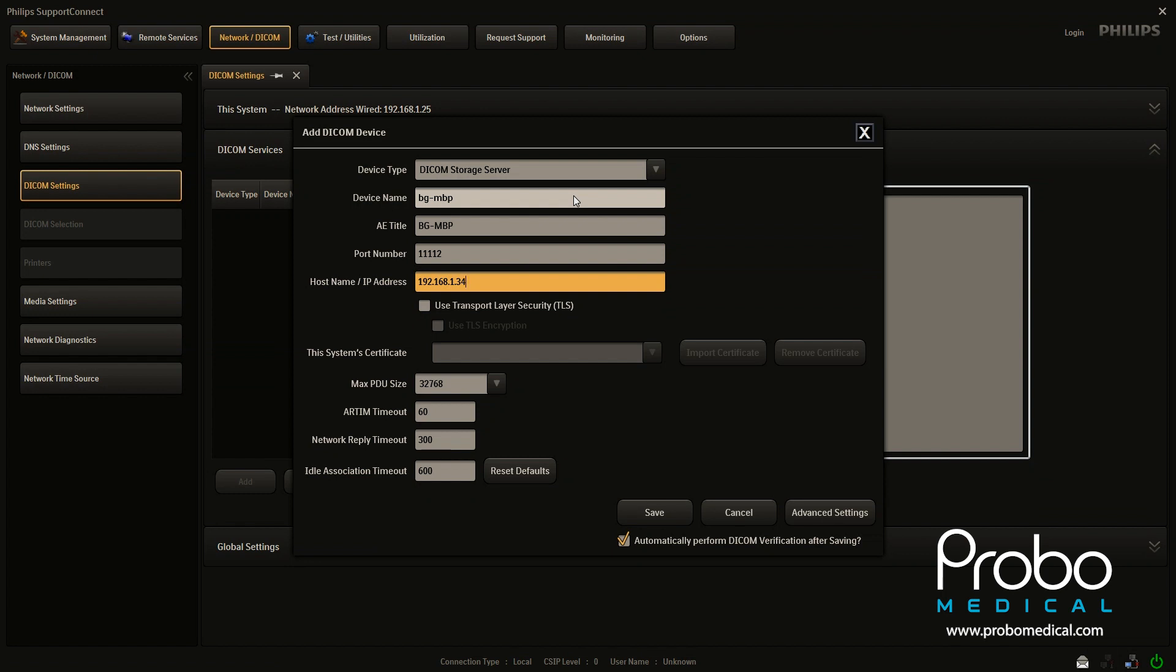The next line, the AE title, the AE title is not something you can choose. That is actually going to be defined by the PACs company. Whoever that company is, they're going to have an AE title.